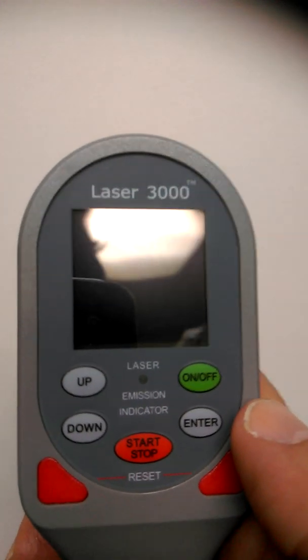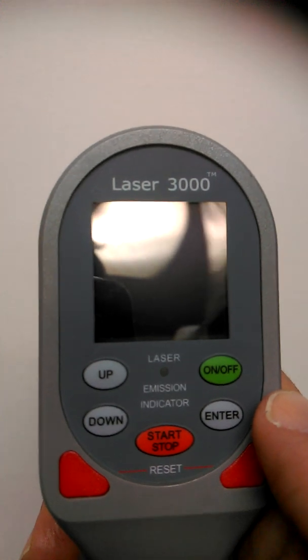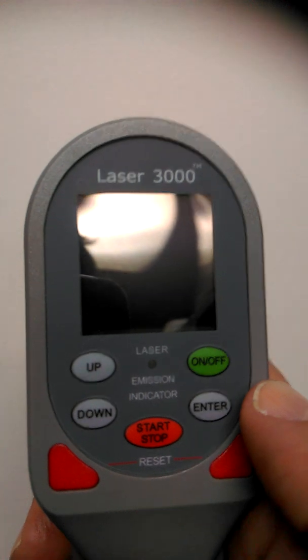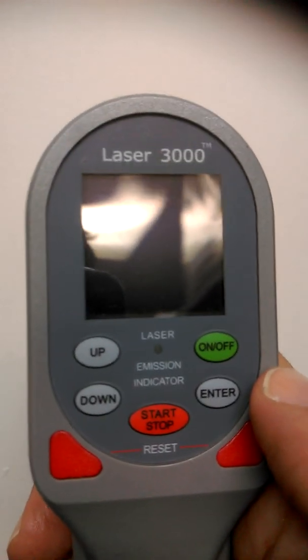When you receive the 3300, it will come pre-programmed with six dosages — three for indoors: M1, M2, M3 at three, four, and six joules respectively, and three for outdoors: M4, M5, M6 at three, four, and six joules respectively.